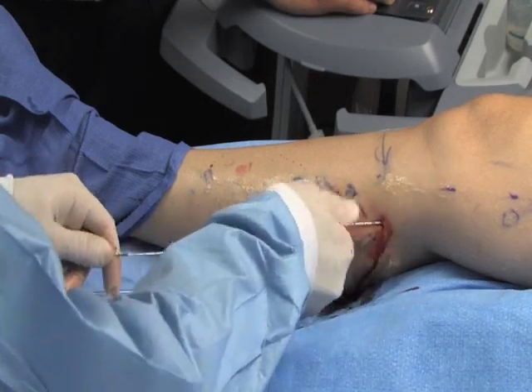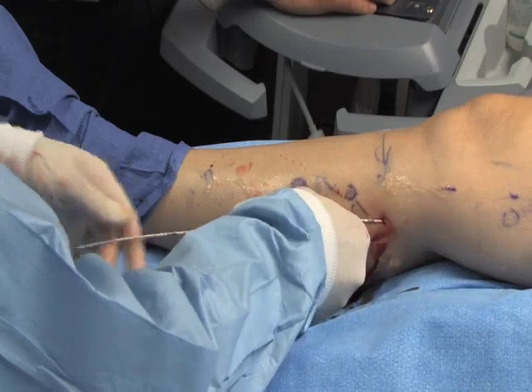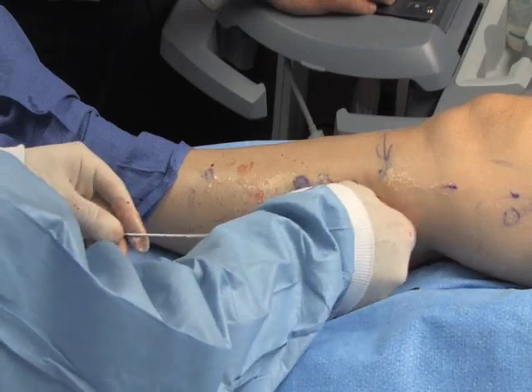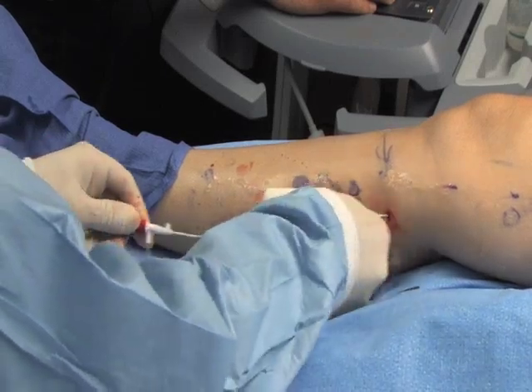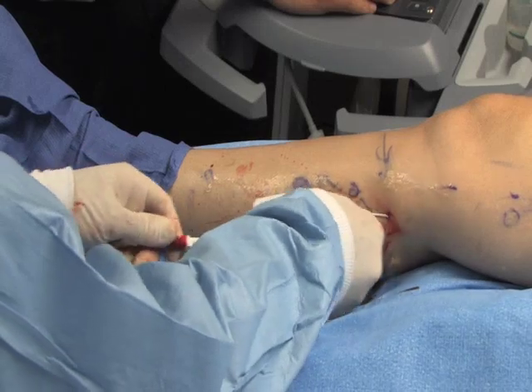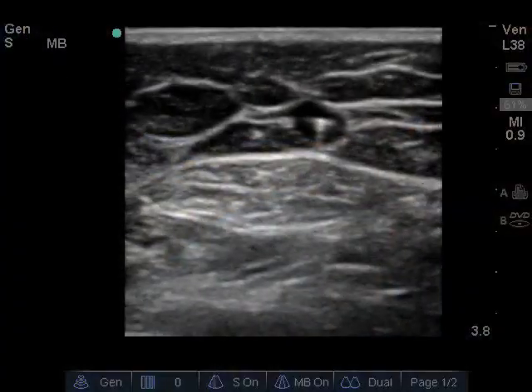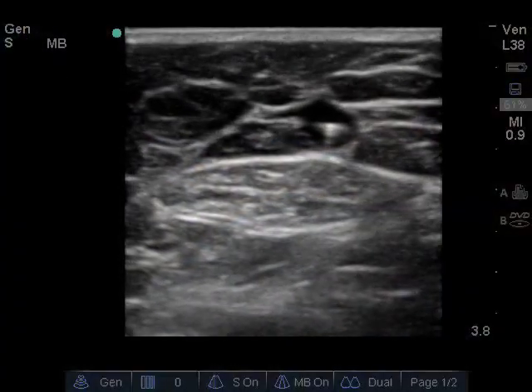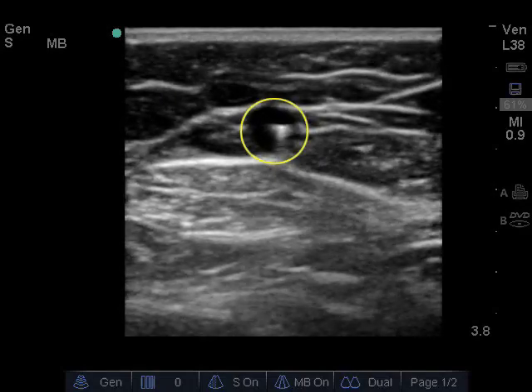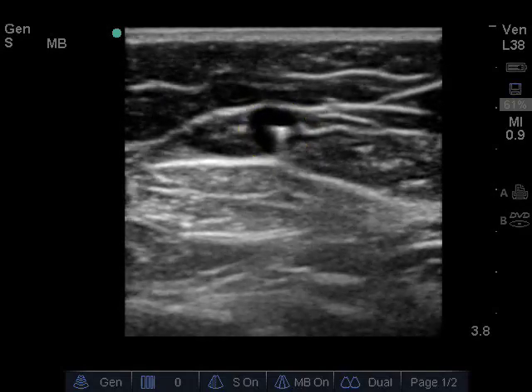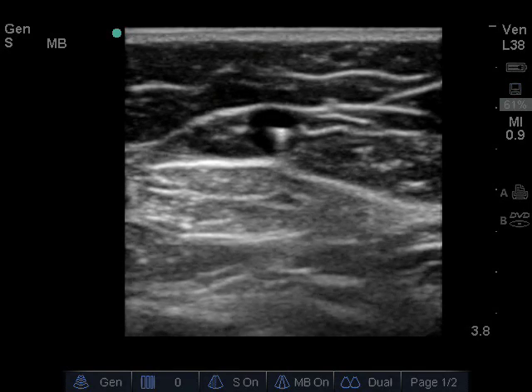The tip of the introducer should be placed 2-3 cm distal to the sapheno-femoral junction. The tip of the introducer can be recognized on ultrasound as a hyperechoic linear structure with a tapering end. Gently wiggling the introducer will enhance its visibility.